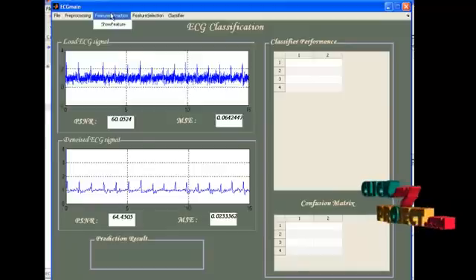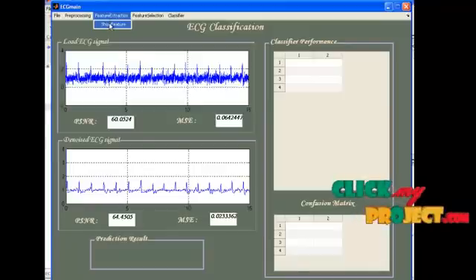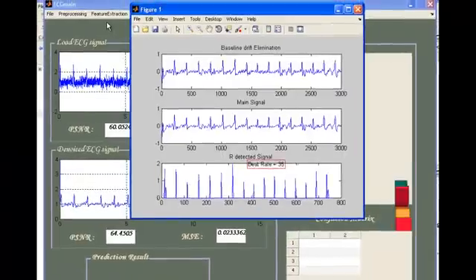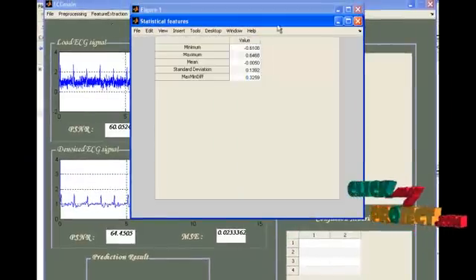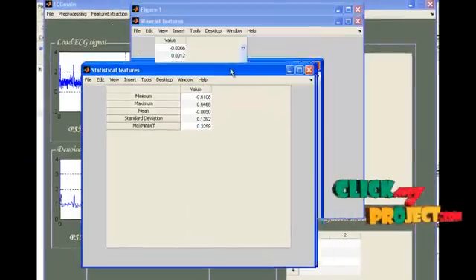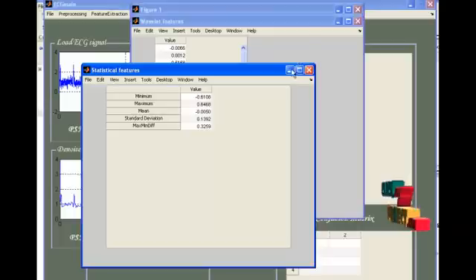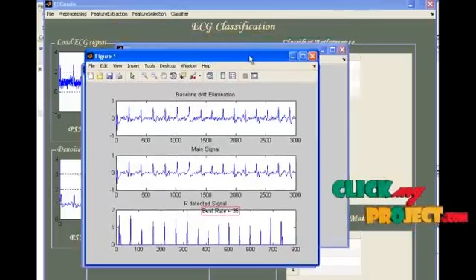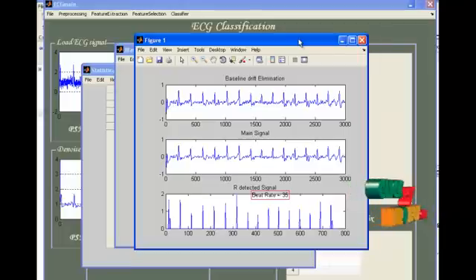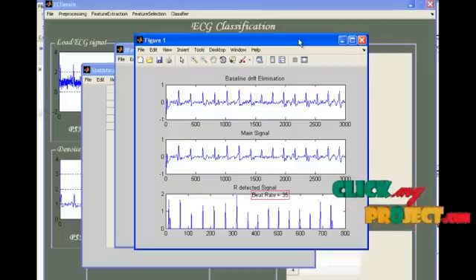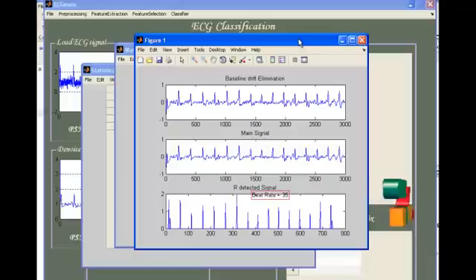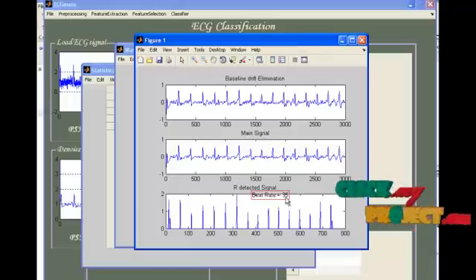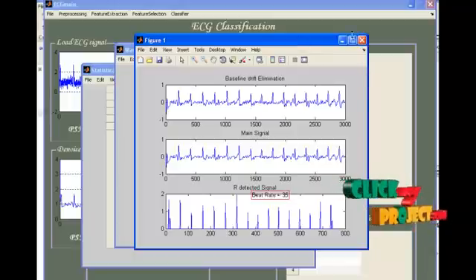Next thing is, under feature extraction, press show feature. Features will be extracted and displayed in separate figure windows. Now, this is the first one that will show the baseline drift elimination, and afterwards, the detected heartbeat rate. Now, it is displayed here. Heartbeat rate is now 35.